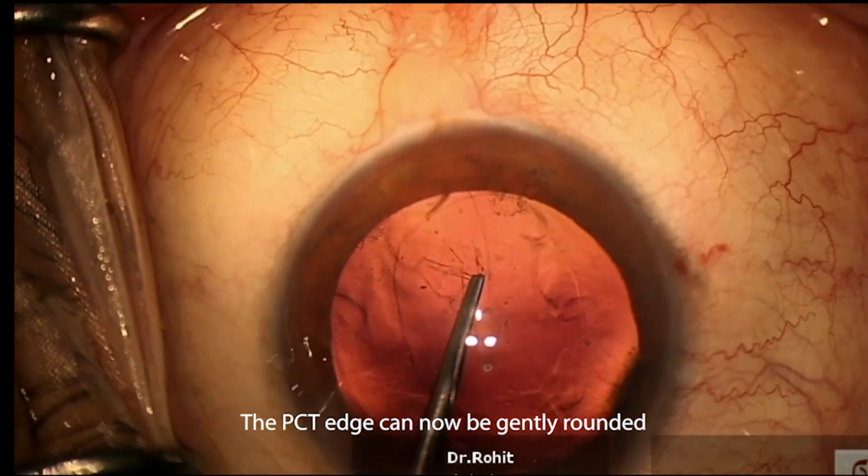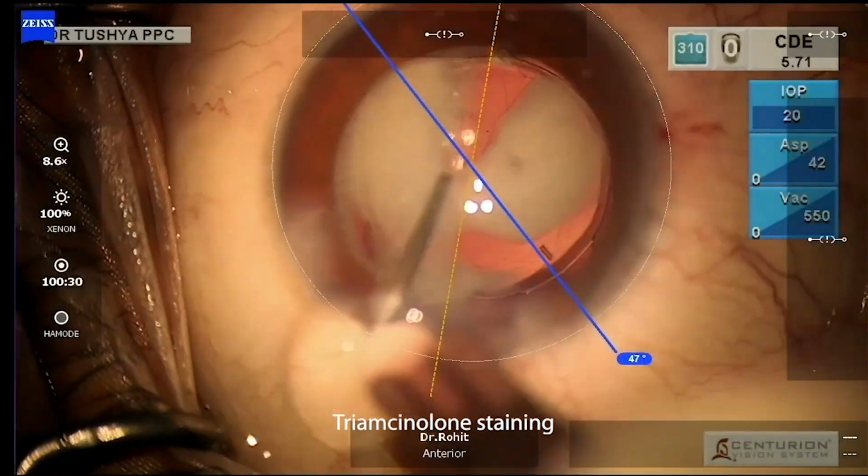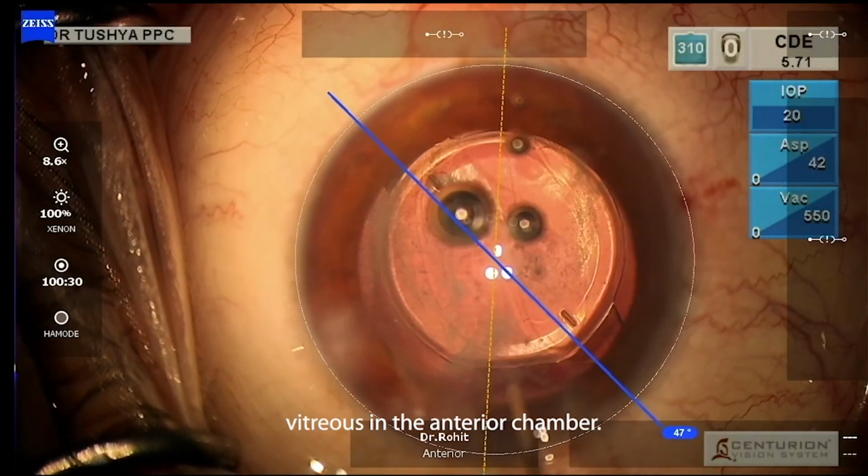The PCT edge can now be gently rounded due to the preserved anterior hyaloid face. Triamcinolone staining confirms the absence of vitreous in the anterior chamber.